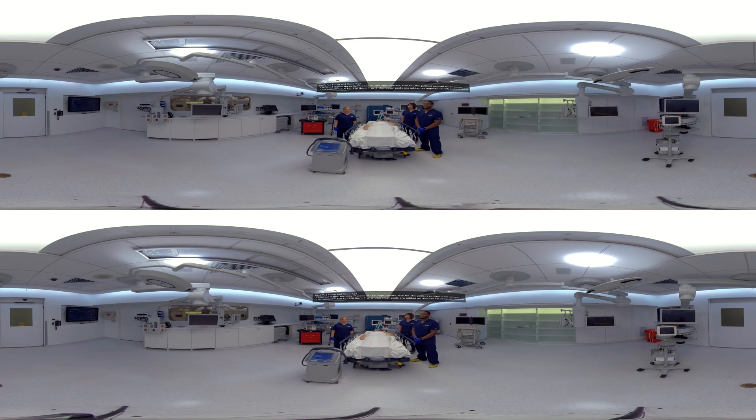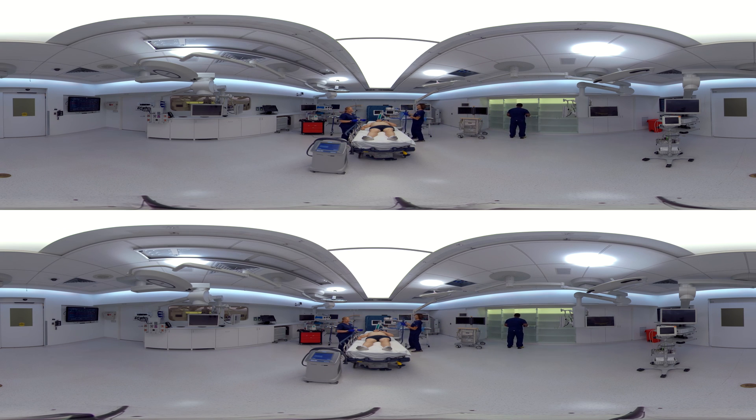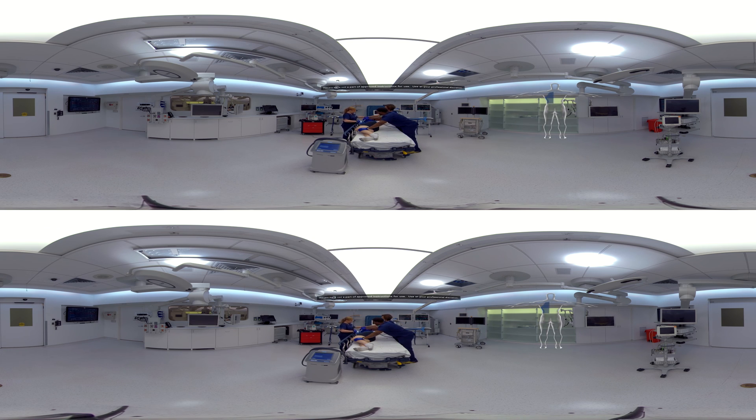Now we're going to demonstrate how to place the Arctic gel pads on our patient. First, we'll start by removing the blanket and lowering the bed rail. Melissa is peeling off the outer layer in order to expose the gel, and then we're going to log roll him to the side. Melissa will line up the long straight edge next to the patient's spine, leaving about a finger width distance to avoid placing the pad on any bony prominence. Then we can roll him back over, and the pad will wrap around the patient's abdomen.